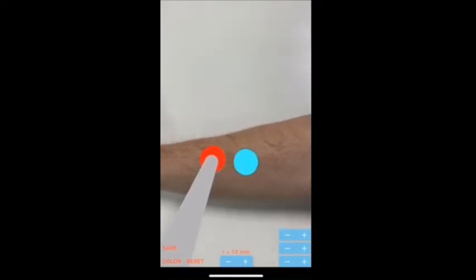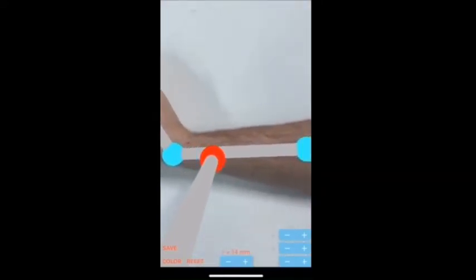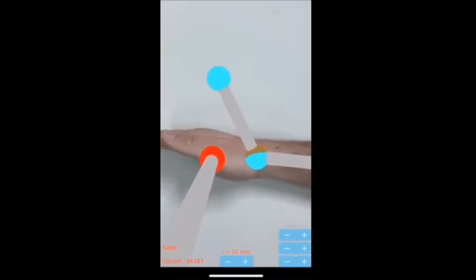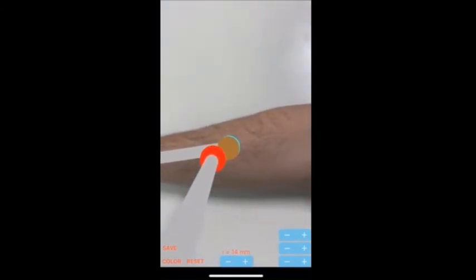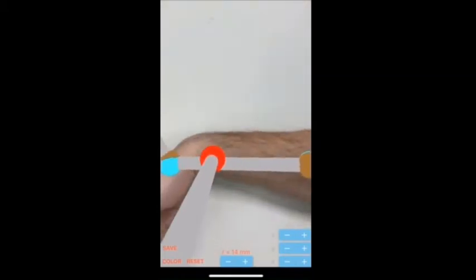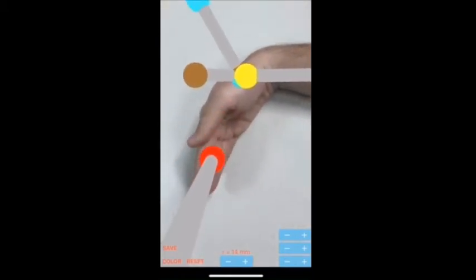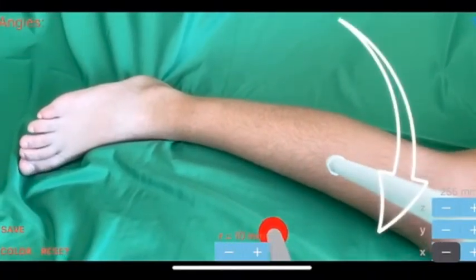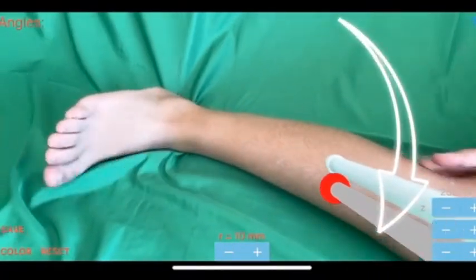The ARorthopaedicGoniometer App is medical software aimed at orthopedic surgeons, physicians, physical therapists and veterinarians, providing tools that allow doctors to determine in the most accurate way possible, using live images directly from the camera and space angles, thus easily estimating range of motion. By marking 3 points by touching the phone screen, a colorful sphere is printed in augmented reality each time while seeing the joint of the patient on screen.